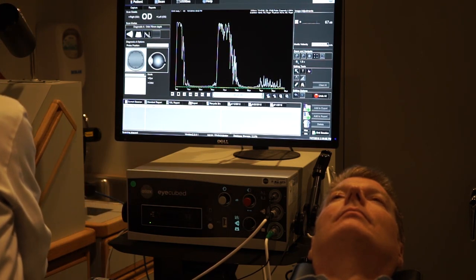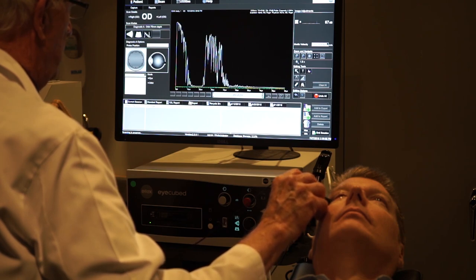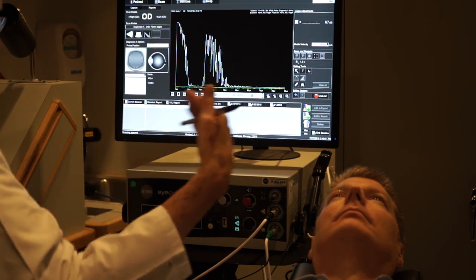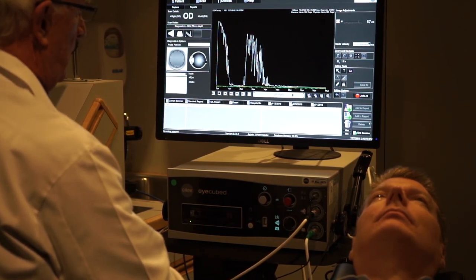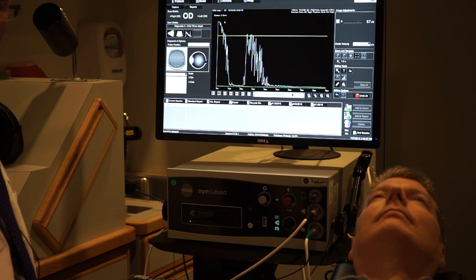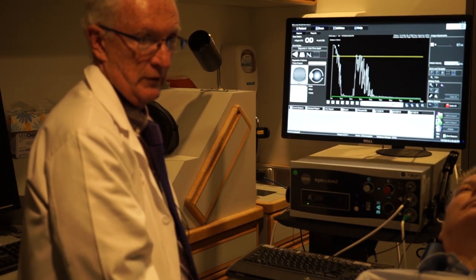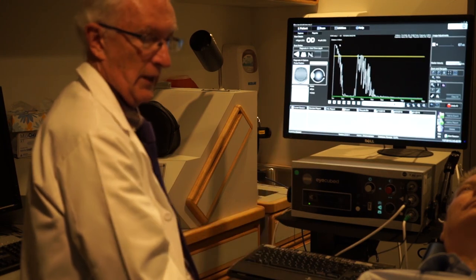Finally, the optic nerve — I can demonstrate and quantitate it. I usually go temporally, but sometimes the way the nerve kinks it's hard to capture, so I'll try both nasally and temporally. In this patient it shows pretty well. Right here is my spike of the nerve — from there to there, close to the globe where it comes out of the back of the eye. I can measure the nerve thickness from that point to that point using my electronic caliper, and that tells me the nerve thickness, which is normal. This is very helpful for following patients with Graves disease, muscle thickening diseases, optic nerve problems, increased pressure, endocranial pressure with pseudotumor cerebri, papilledema, and optic nerve tumors — all of these can be looked at with quantitation.